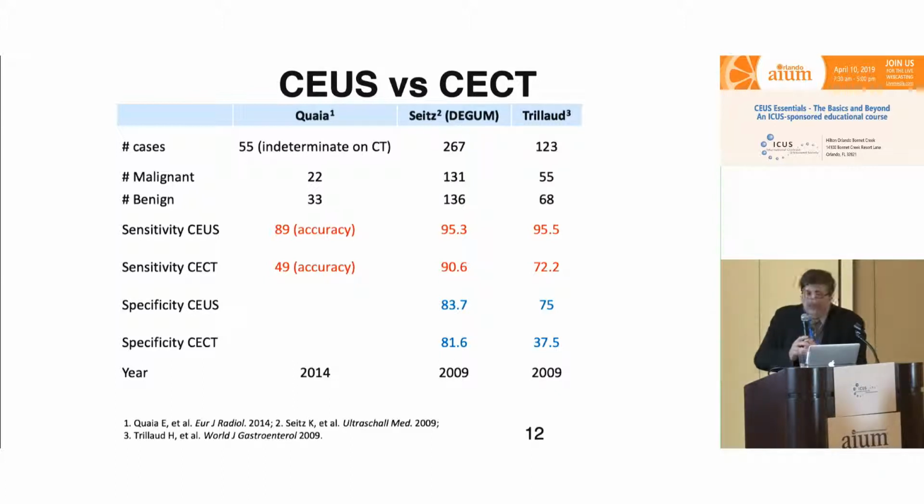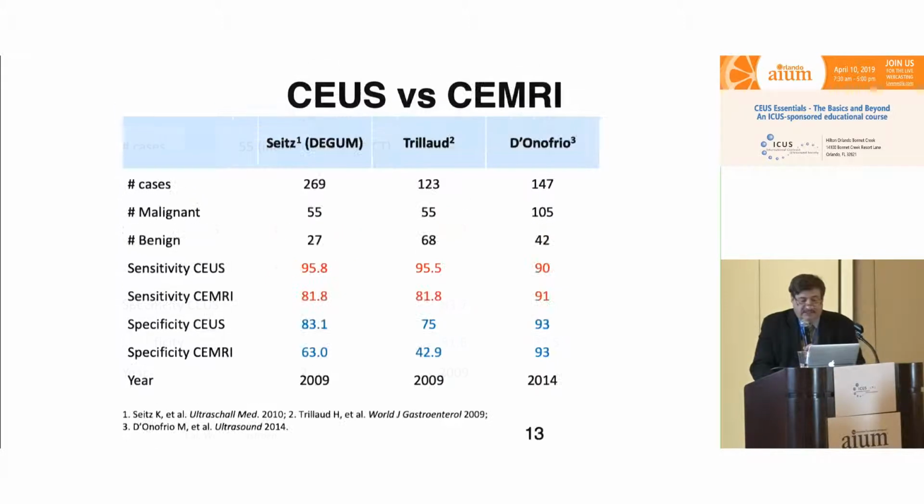So I think Stephanie has been another proponent. When CT and MR can't answer a question, doing CEUS can often answer that question. The other 2 studies, again, showed superiority in both sensitivity and specificity of contrast-enhanced ultrasound over contrast-enhanced CT.